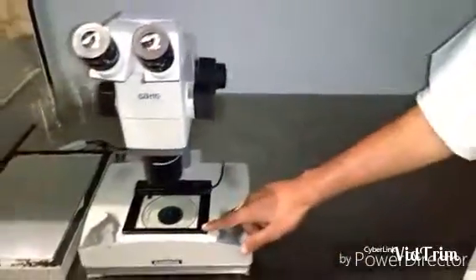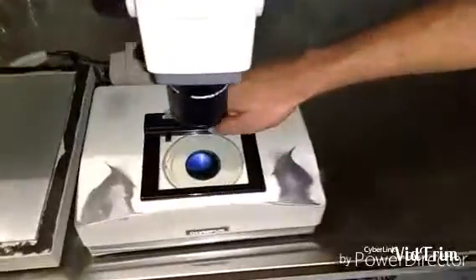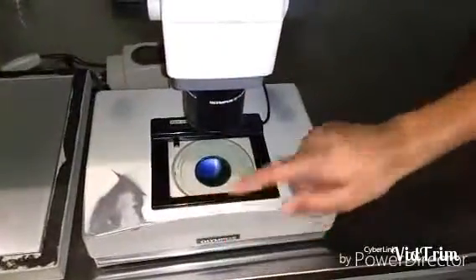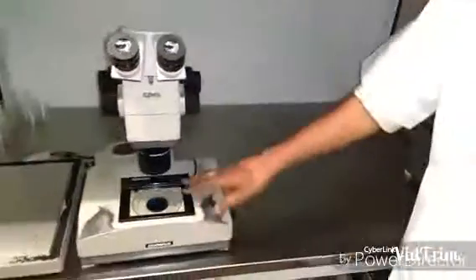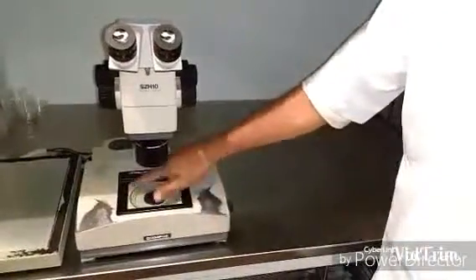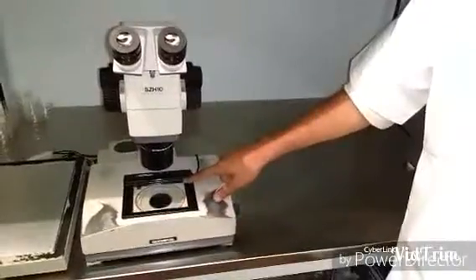The microscope has a stage warmer which ensures that we are performing the procedures at 37 degrees Celsius, which is very critical. We can also check the temperature of the stage warmer using a digital thermometer.